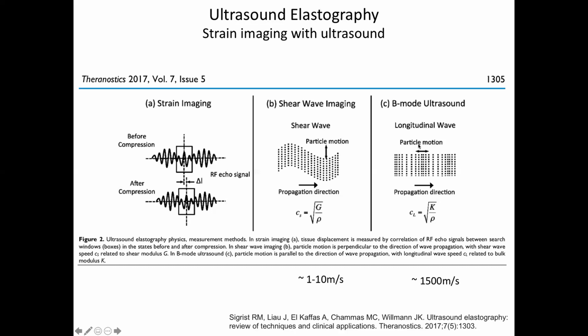So actually doing strain imaging with these waves is very hard, right? Because everything's happening a little too fast. Here, you can measure a difference in the shear modulus between one tissue and another if you have this wave moving through and your ultrasound is perpendicular to that, right? And you measure that displacement. The way you measure that displacement is you have an echo, the raw ultrasound signal coming back, and it's been literally displaced after the strain has been applied.